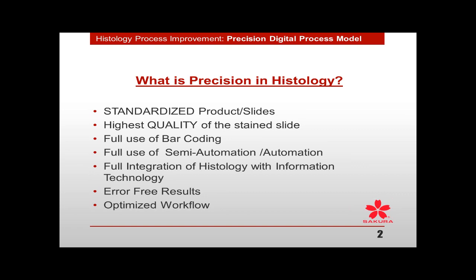And then again, unfortunately, when you bring this into your laboratory, you're going to have to re-optimize your workflow. Small batch, small batch, small batch. You're going to have to figure out, once you place in the digital scanning, how you're going to be able to optimize your workflow to get all of this done within pretty much the same sort of time constraints we've always had to work with.